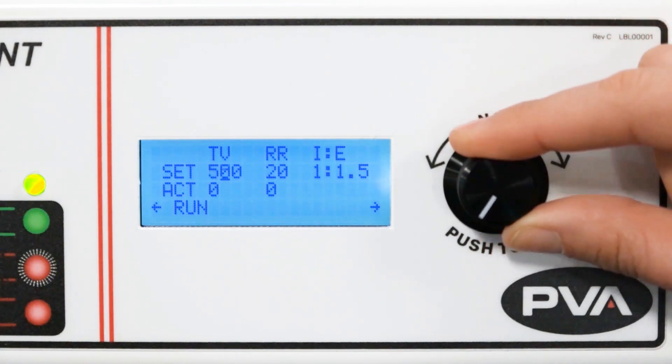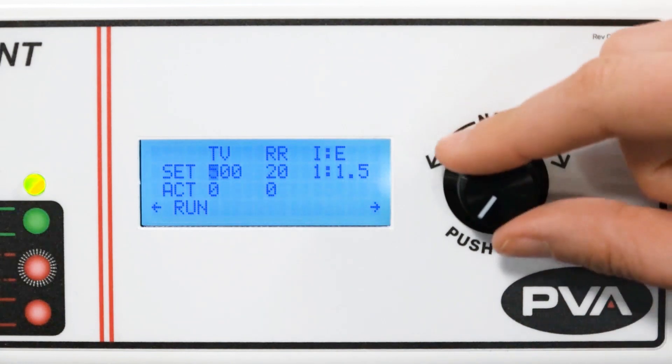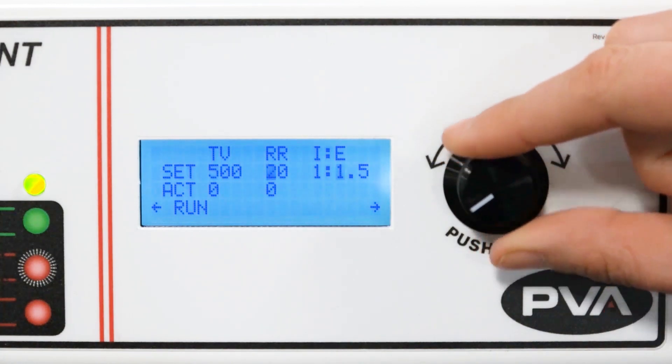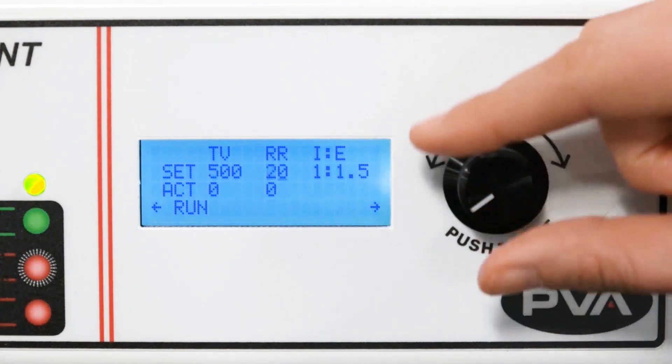To set a parameter, press the knob once, then scroll to the right or left to adjust the parameter. To set this, press the knob again.